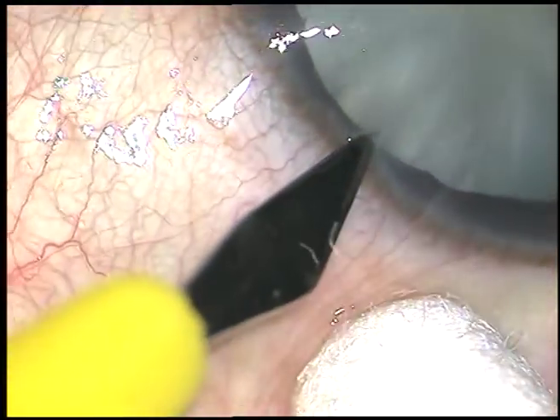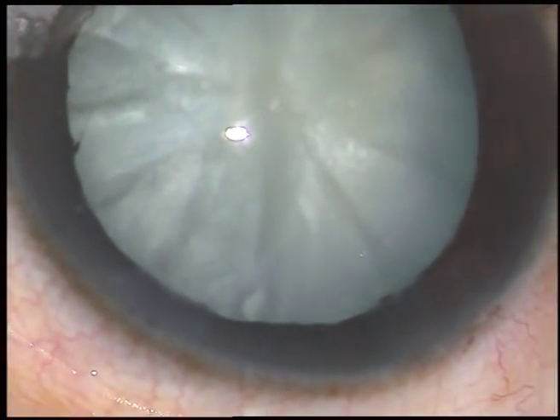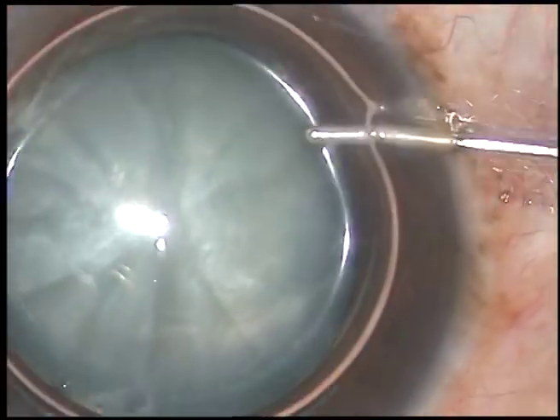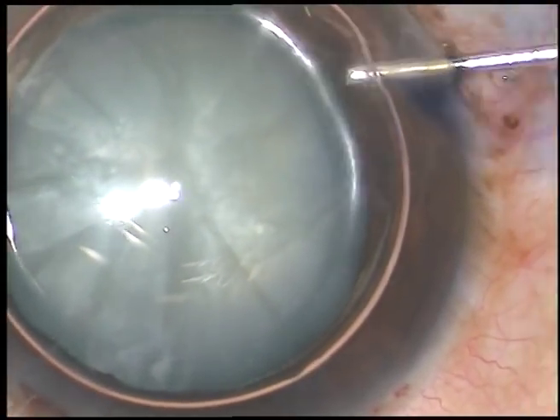By this time, in this case, the main incision and two side ports have been made. And now I am going to inject an air bubble, and underneath this air bubble, I am going to inject trypan blue dye. And here goes the dye.